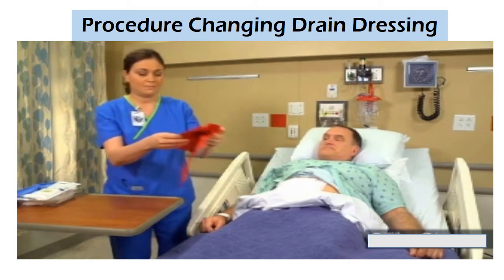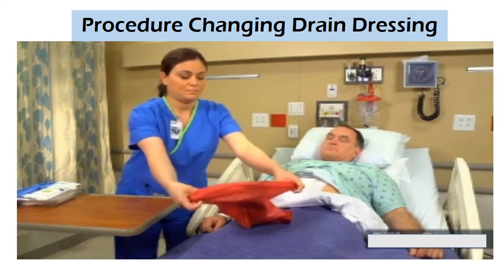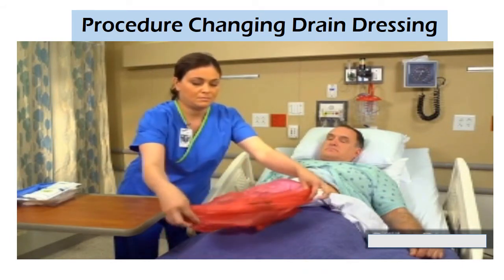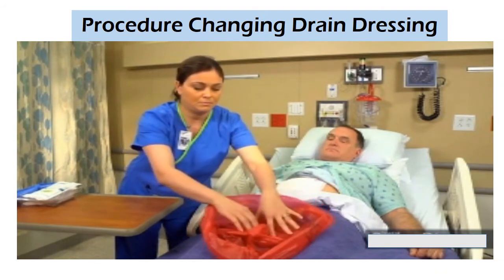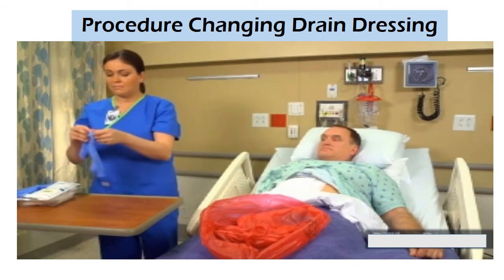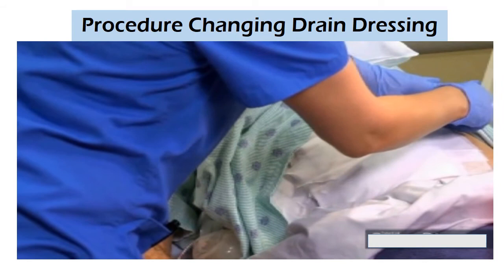Place a disposable biohazard bag within reach of your work area. Fold down the top of the bag to form a cuff. Apply clean gloves.